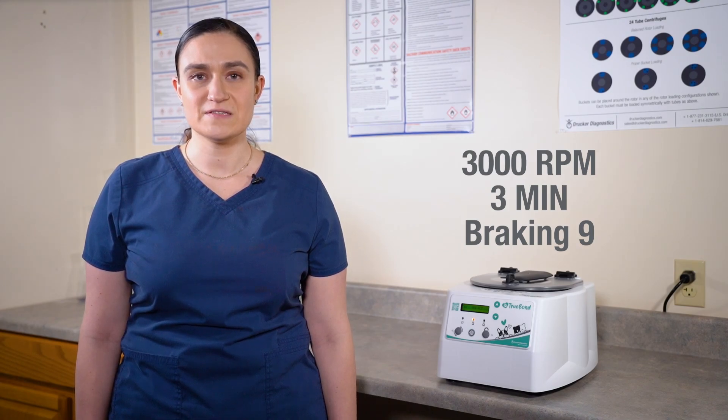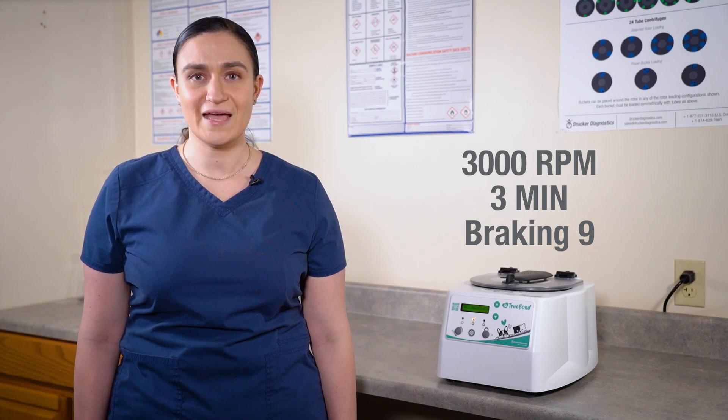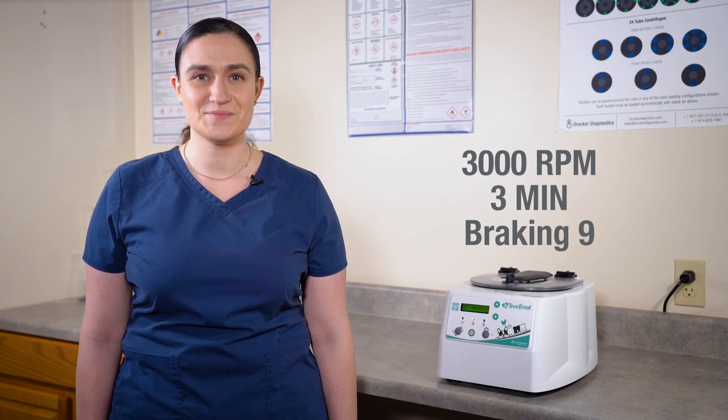We're going to adjust Memory 6 to run at 3000 RPM for 3 minutes with braking of 9. But you can use this same process to create whatever custom cycle you would like.